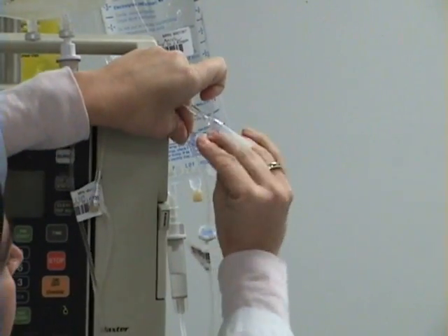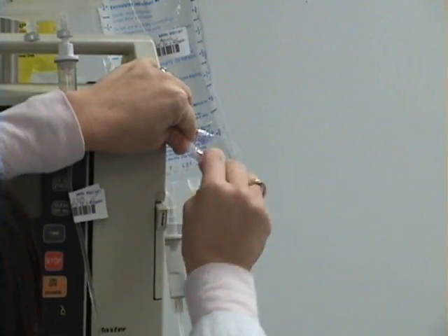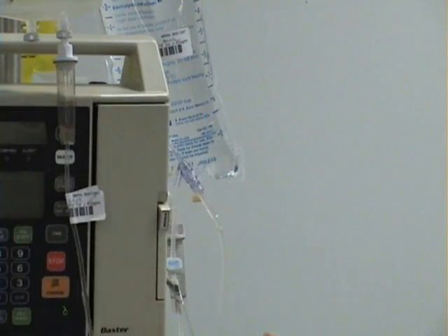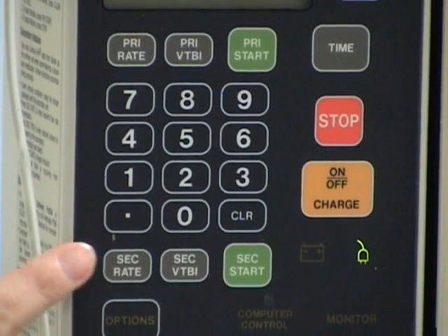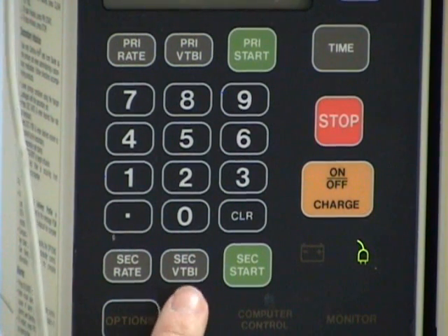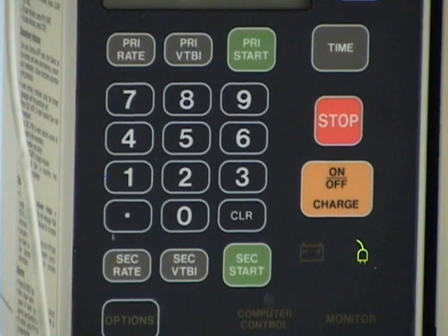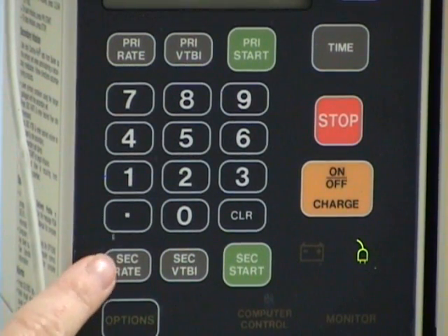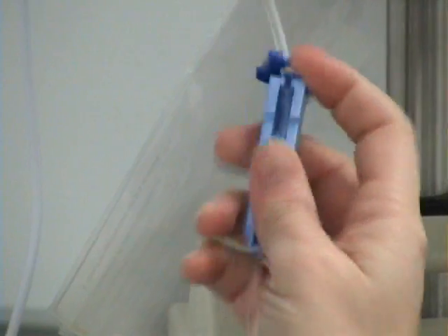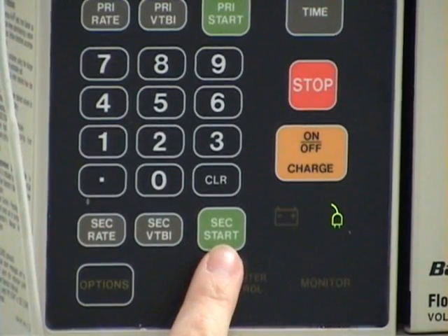I will swab the port with an alcohol prep and attach the tubing. I will now program the pump for the infusion. I will go to the secondary volume to be infused. The piggyback has 50 mLs, so I will press volume to be infused: 50 mLs. The rate is to run at 150 mLs per hour. I will press the secondary rate, then 150. Then I will unclamp the roller clamp of the secondary line, then hit secondary start.